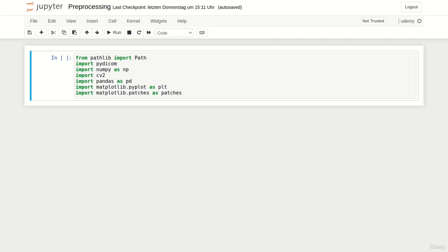PyDicom to read the DICOM files, NumPy to store the pre-processed files, OpenCV to resize all images, Pandas to read the provided labels, Matplotlib for visualization and additionally patches from Matplotlib to draw the bounding boxes around the heart.